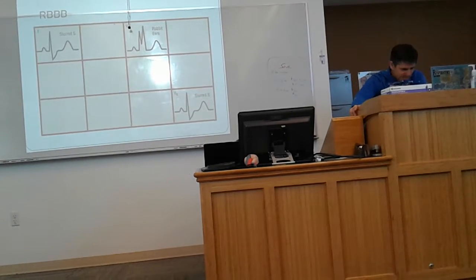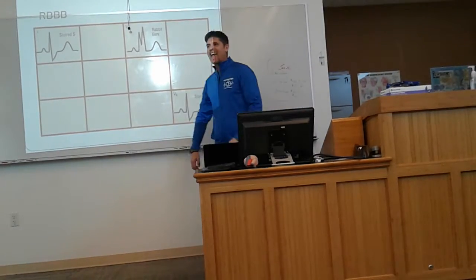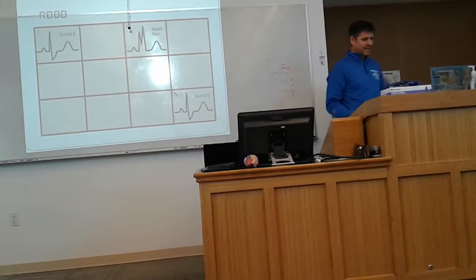Well, this is also a right bundle branch block. Isn't that great? Hey, look at number 7, just for fun.